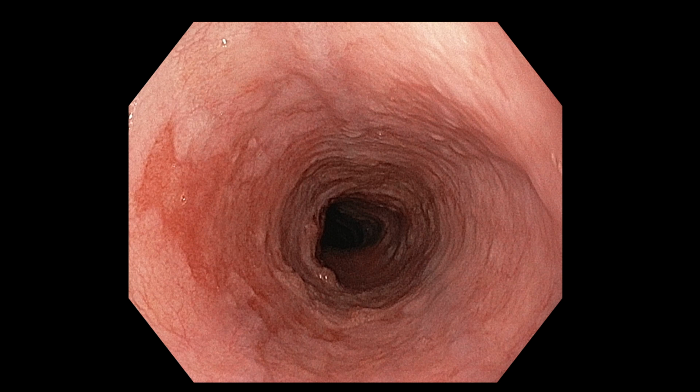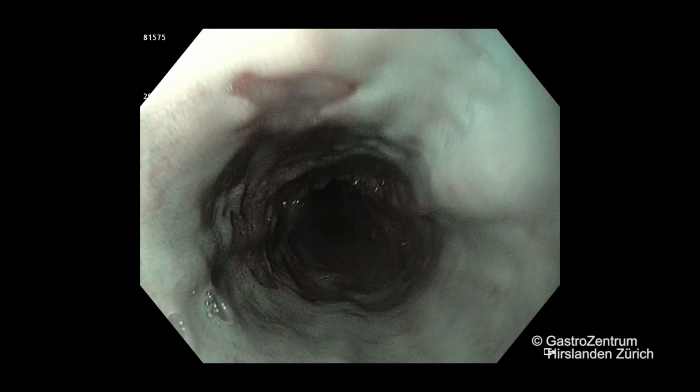The first point is when we look at the squamous cell epithelium, we have to look for reddish changes in the regular squamous cell epithelium, because this is the first indication for us that something is wrong. So in this picture, we also see this slight elevations of the mucosa, and we have now a video using NBI.